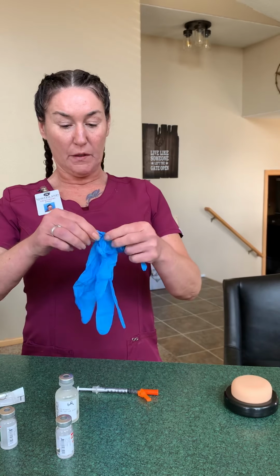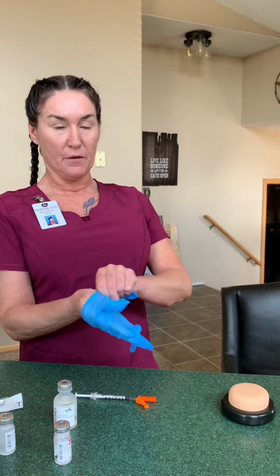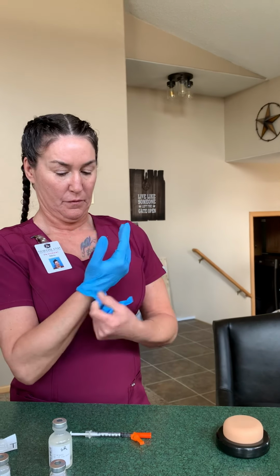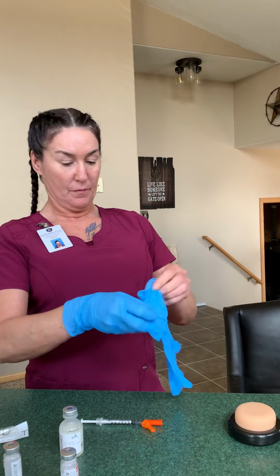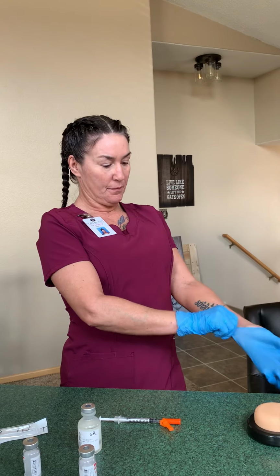I'd start by getting the name and date of birth of my patient, making sure they were comfortable and ready for their injection shot. And again, if they had any questions for me. It's 30 minutes before breakfast time, so we're giving our shot at the appropriate time.